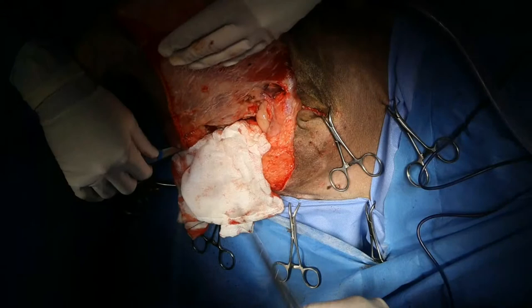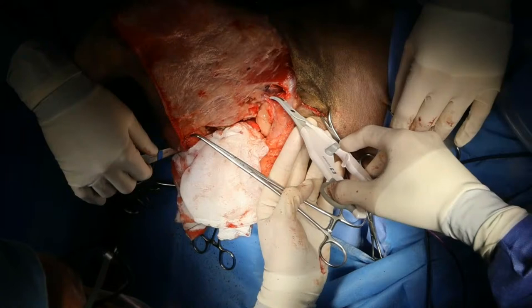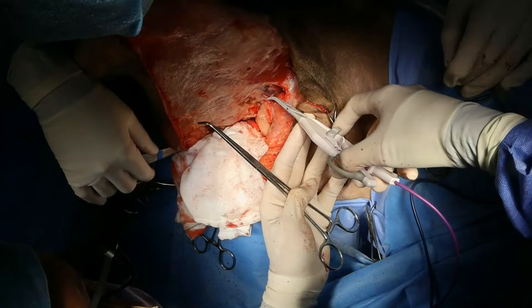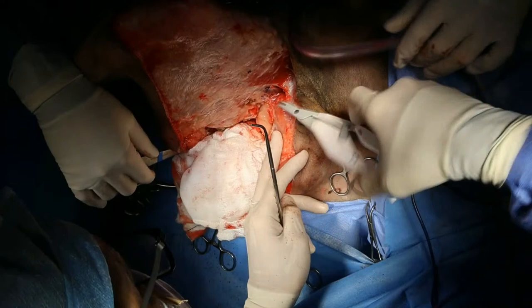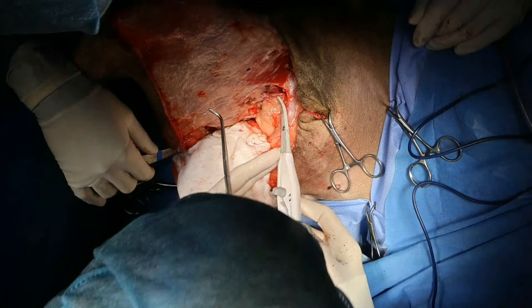Now there are a few branches in here that we're going to try to address. I think this one is small enough to ligature through. So this is about 3 millimeters in diameter. Okay, so I've got another big fat vessel right there.